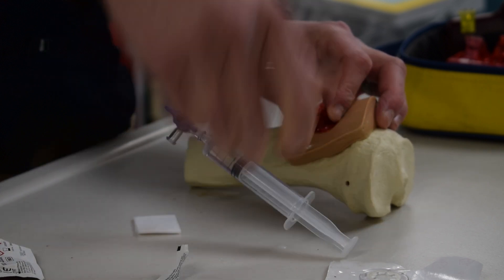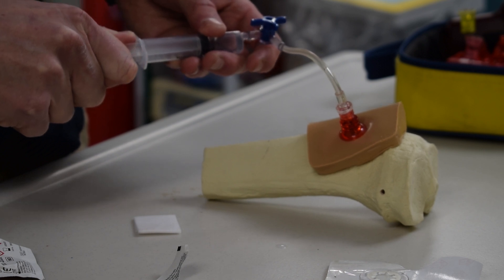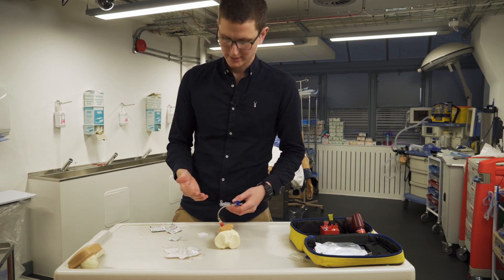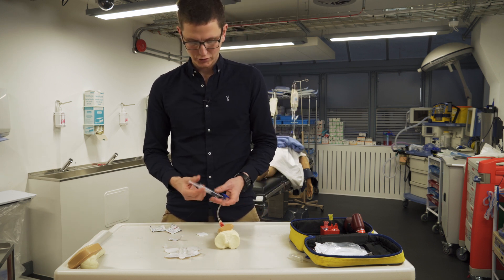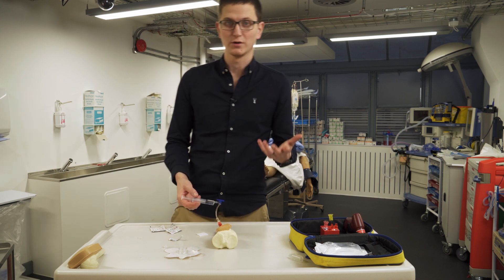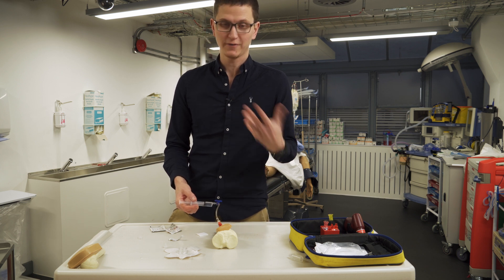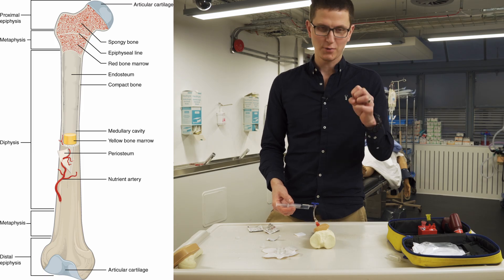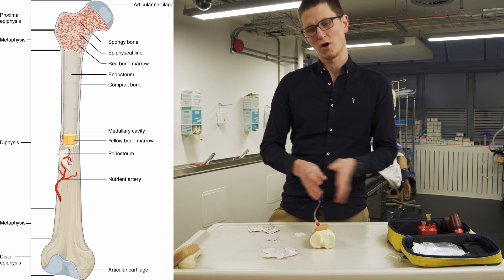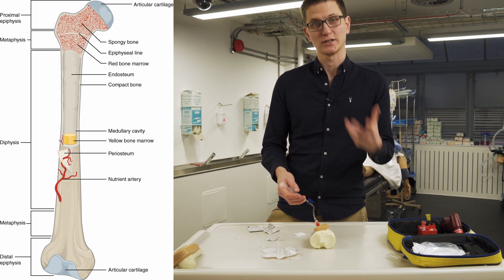I'm going to connect on here and aspirate - pull back. When I pull back, I should see blood. You can get bone marrow - you don't always get bone marrow, but you can. Then you're going to inject. The injecting and flushing is the most painful part of the procedure. I'd be happy for you to put the needle in my leg, but I wouldn't be happy with you flushing it. Because the bone is made out of a web-like structure, the harder we flush it, the more of that structure we open up - and the more we open up, the better this IO actually runs.